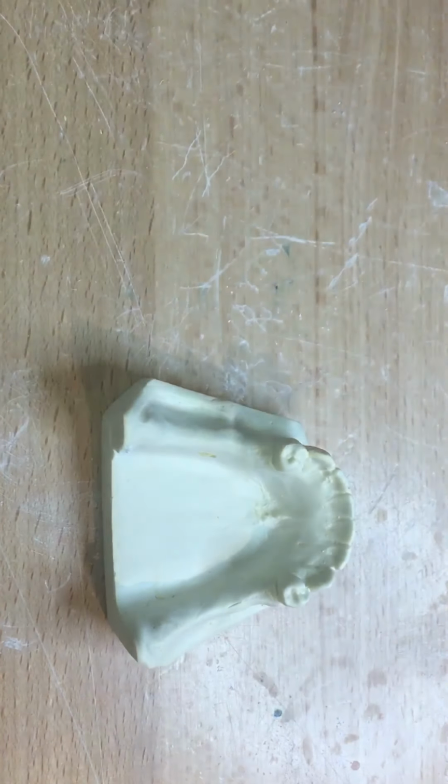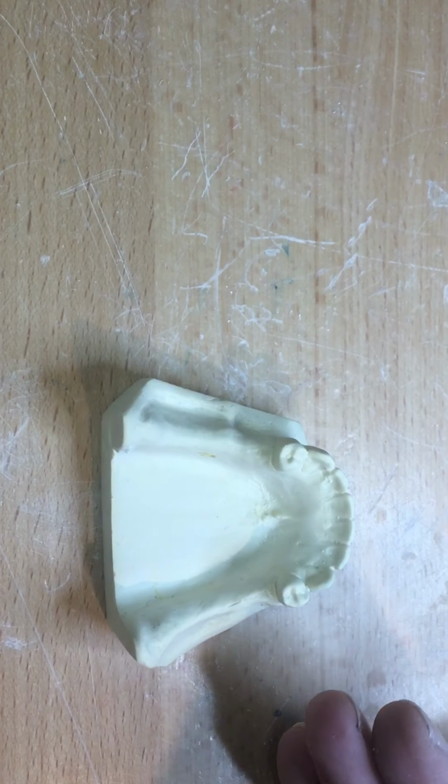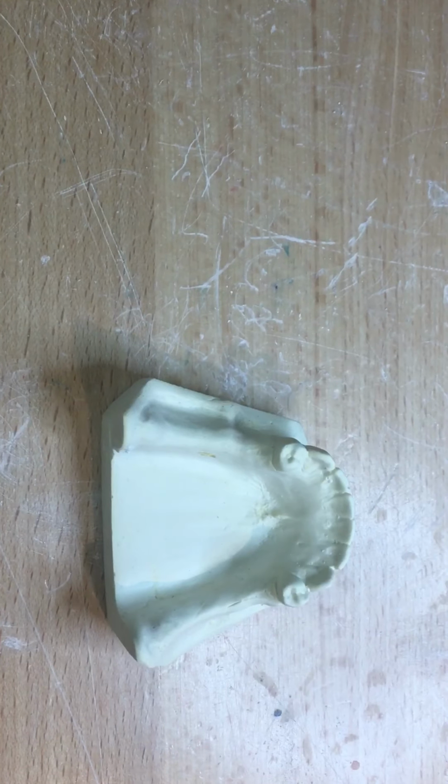I'm going to make an occlusion rim. So why would I need an occlusion rim for the bilateral free end lower? I mean, it's obviously dependent on the opposing dentition, especially if it's a full denture or a large span Kennedy Class 4, we'll be taking bite registrations.